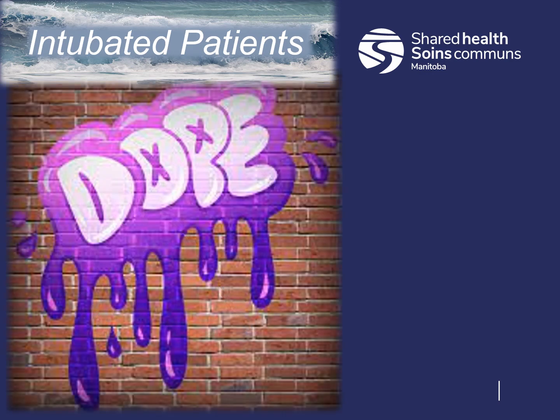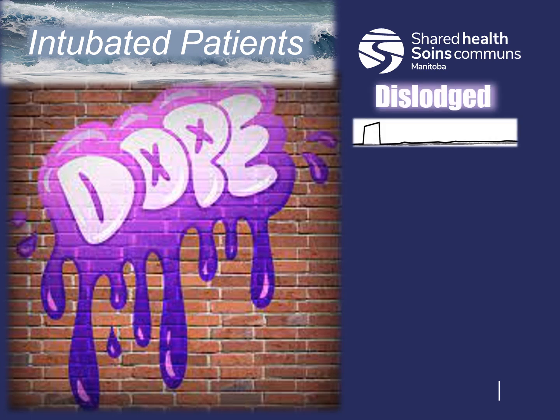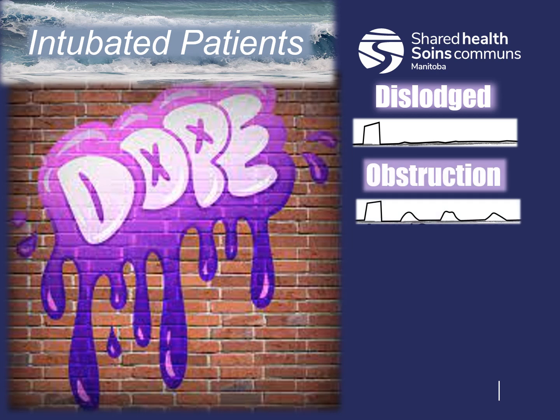And again, another mnemonic to troubleshoot the loss or the changes of the waveform. Is the tube dislodged? Do we see complete loss of waveform? Is that tube still where it needs to be? Obstruction: do you see changes in the waveform? Has the patient vomited? Is there mucus present? Does that patient need to be suctioned?